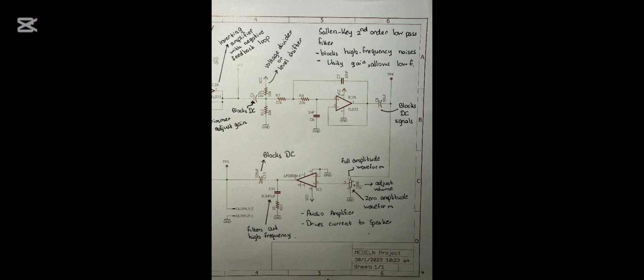Then stage 3 comes. The signal passes through C5. C5 blocks the DC signal and the signal enters into IC2A of the TL072. The IC2A is patched as a Sallen-Key second order low-pass filter. R7, C7, and R8, C6 form the second order low-pass filter. R11 and R12 form the voltage divider and hence act as the level shifter.